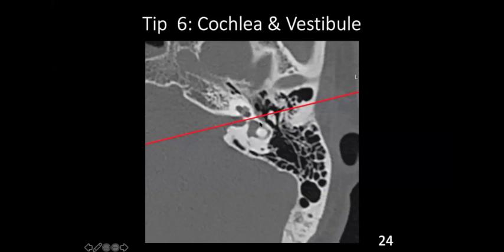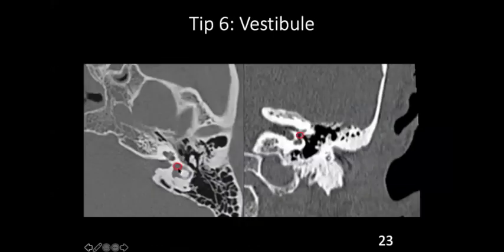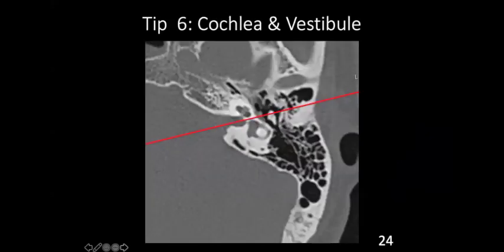Even on a coronal section, you can see: this is the vestibule in the center, this is the semicircular canal, and this is the cochlea. On a coronal section, vestibule is in the center, semicircular canals are in the upper part, and cochlea is in the lower part. Cochlea is below and semicircular canals are above — vestibule is in the center. That you should remember.